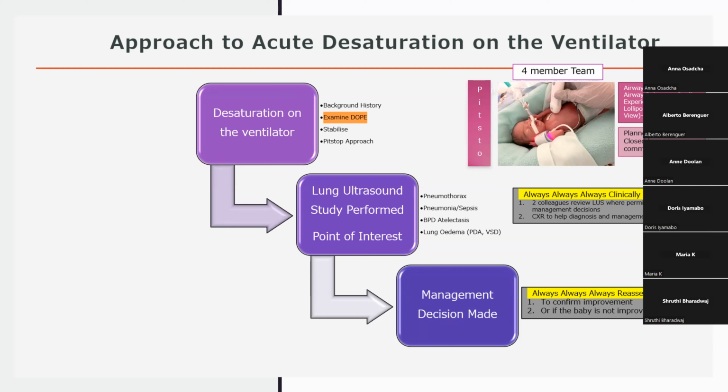I'd say during the phase of deterioration, again, you have to be really careful. Small things like ultrasound compression of the chest can actually add to deterioration because you'll interfere with recruitment of the lungs. And it's really, really important that if you're doing an ultrasound, and Nadia will talk about that when she takes the safer approach, that you start based on your clinical history with the point of interest.